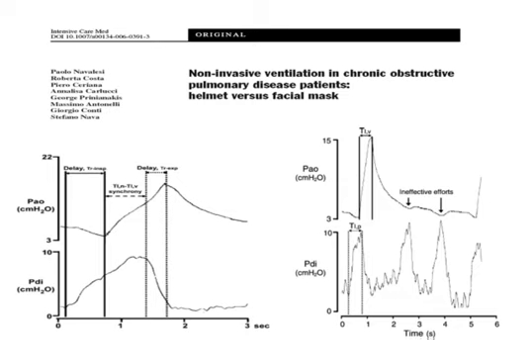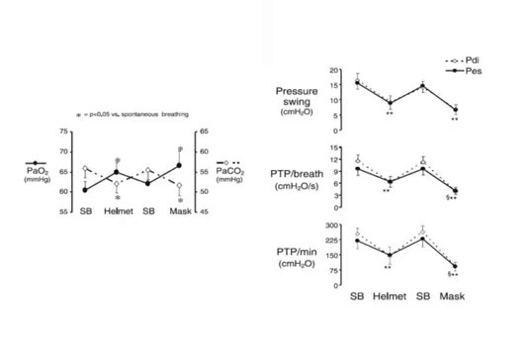And then we have a short time of assistance, and during helmet ventilation, especially in COPD, this is something that can be frequent because we can have a triggered breath and then we can have 2 wasted efforts. So the work of breathing of the patients is not decreased, and this is our goal of mechanical ventilation.